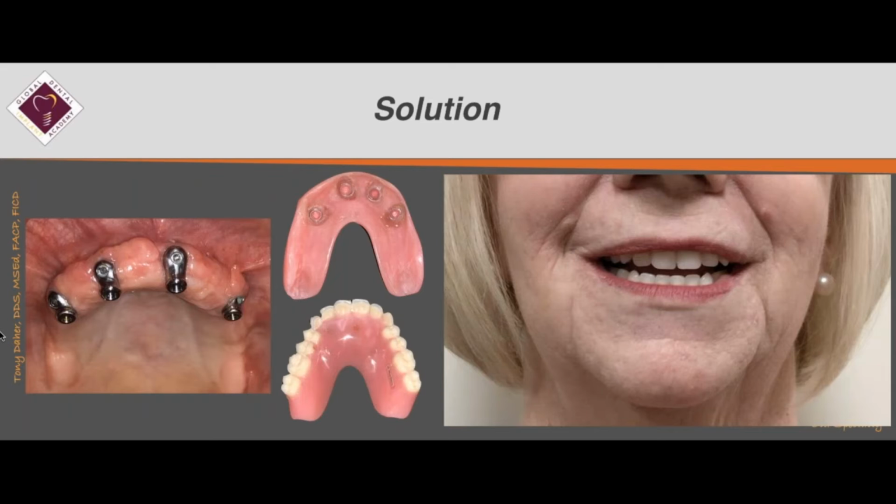And this is the denture. And here, if you're going to pick up these locator clips, you have to do 1 at a time. And even with 2, do it 1 at a time. And I paid my share. How do I know that I have to do it 1 at a time? Because one time I did both at the same time, and the denture locked in place because of that angulation problem, and then I had to destroy the denture to be able to take it out.